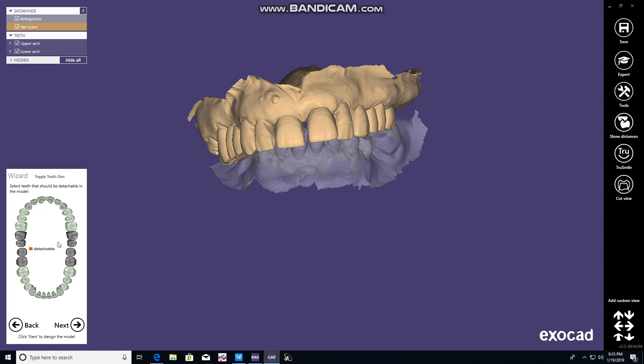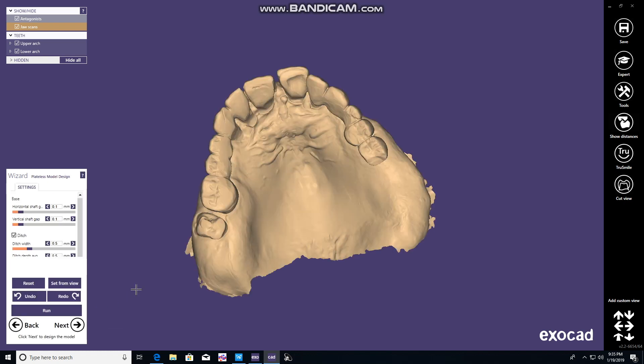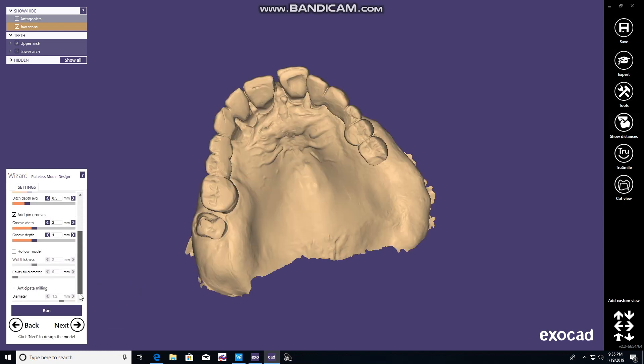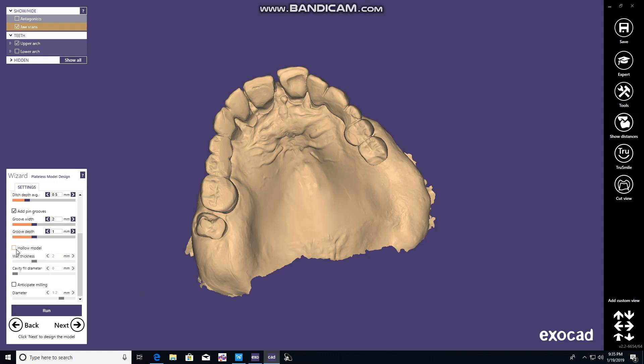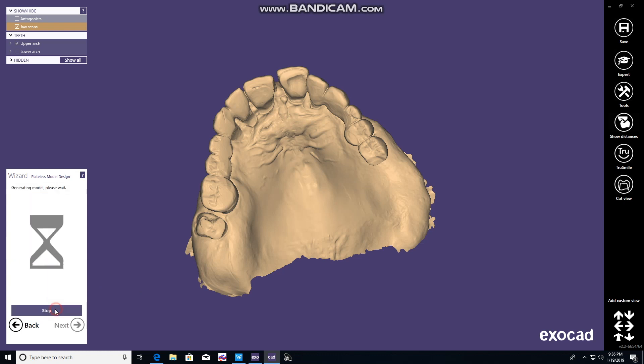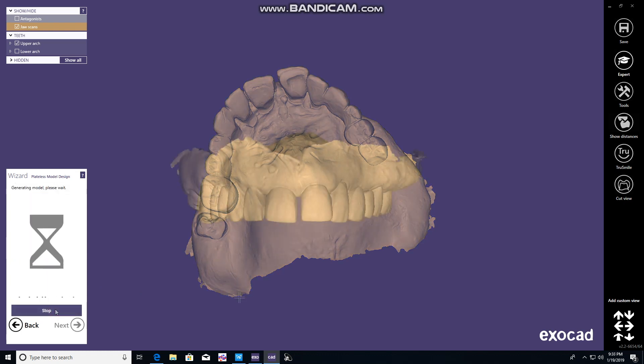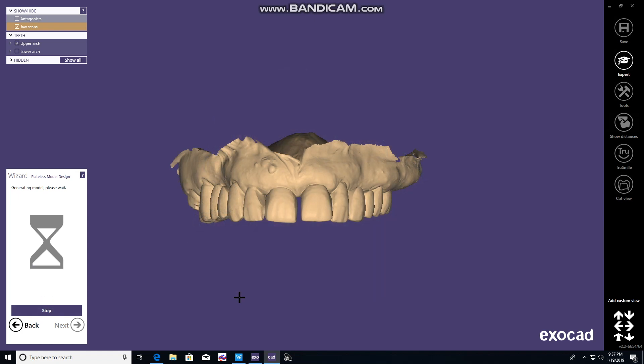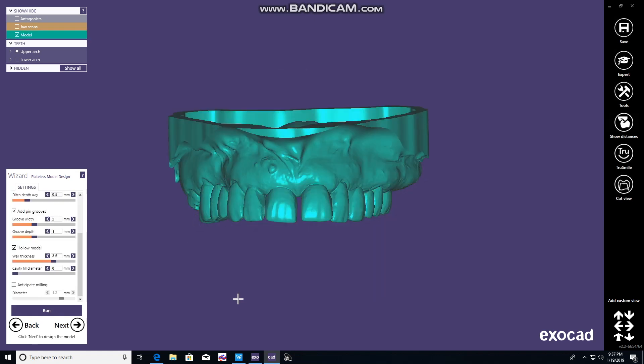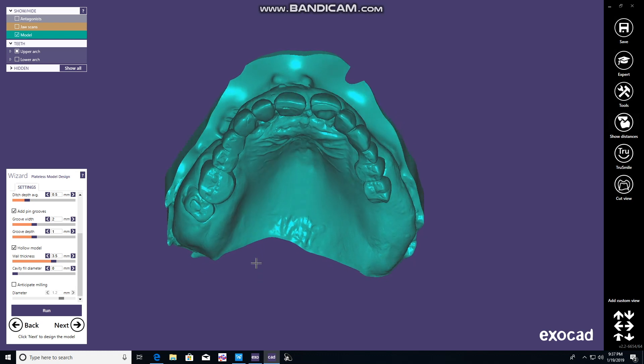Here, just hit next again. We're not doing anything important here. This is where you will change the parameters of your model. We like to hollow our models at 3.5mm borders. You'll run that. It goes for quite a while, and finally it'll generate a model. There you go.